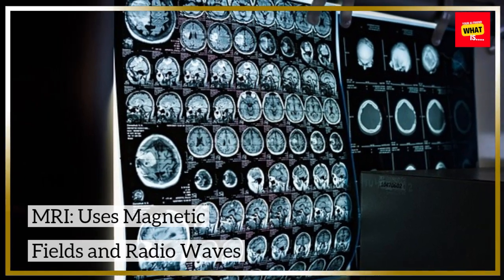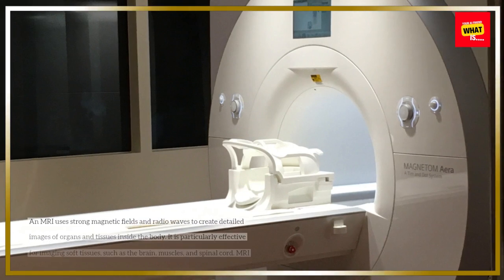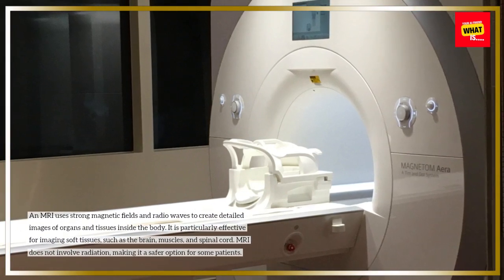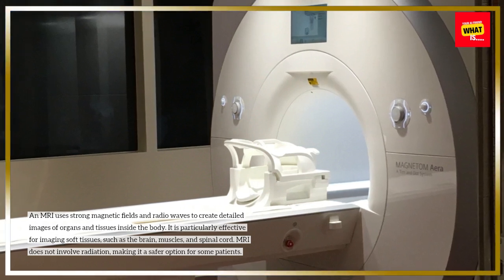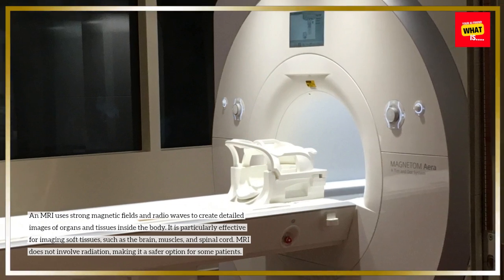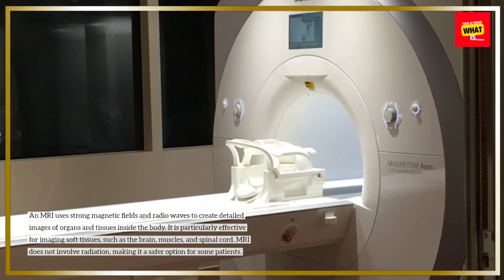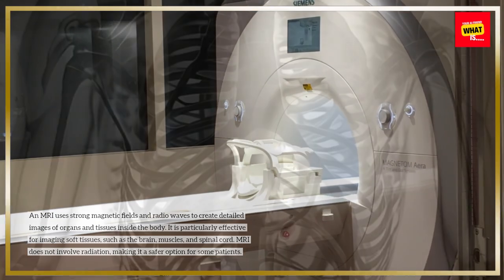MRI uses magnetic fields and radio waves. An MRI uses strong magnetic fields and radio waves to create detailed images of organs and tissues inside the body. It is particularly effective for imaging soft tissues, such as the brain, muscles, and spinal cord. MRI does not involve radiation, making it a safer option for some patients.